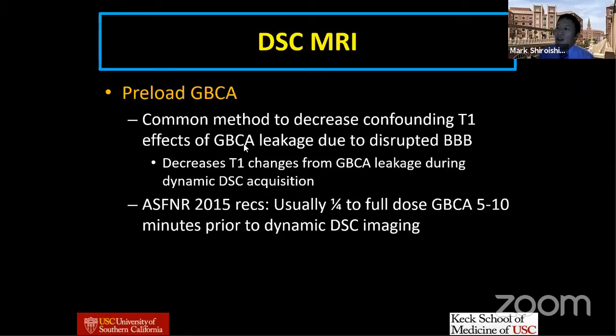So one simple way that people have thought about to try to fix this issue. Now, this is not an issue with stroke because strokes, by and large, don't have that contrast leakage. You don't get that contrast enhancement. The stroke does not light up on the brain scan as it does with high-grade gliomas.